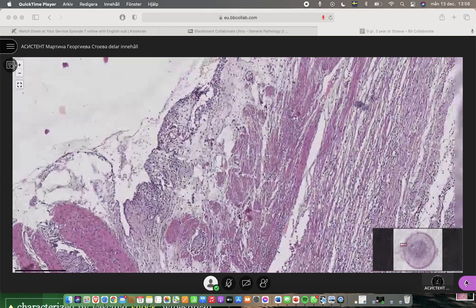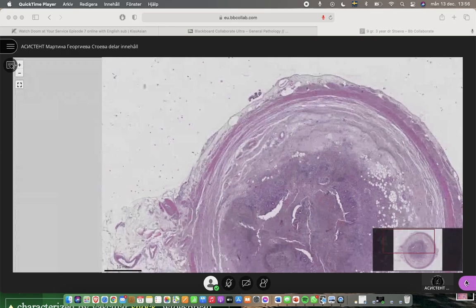This means that this acute inflammation, of course, it's acute when we have such diffuse infiltration by neutrophils. You know that acute inflammation is associated with polymorphonuclear cell infiltration, while chronic inflammation is associated with mononuclear cell inflammatory infiltrate, or lymphocytes and plasma cells are the mononuclear cells.